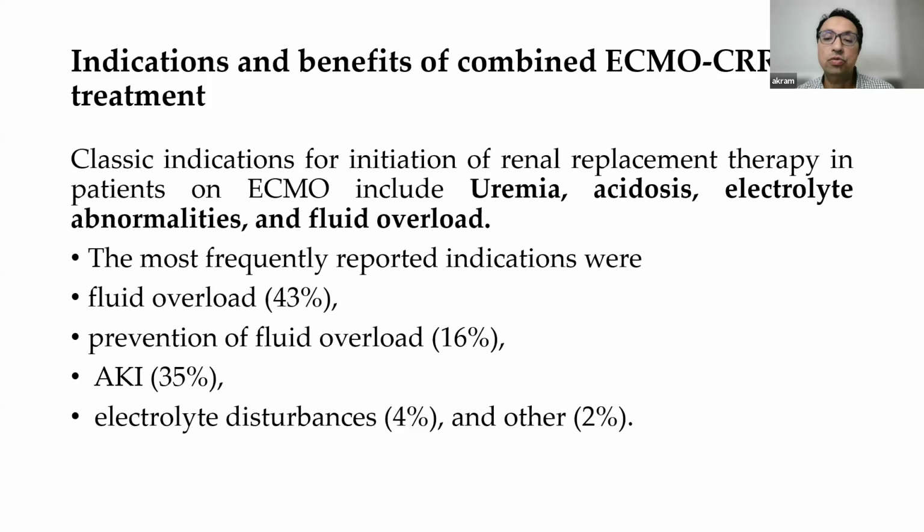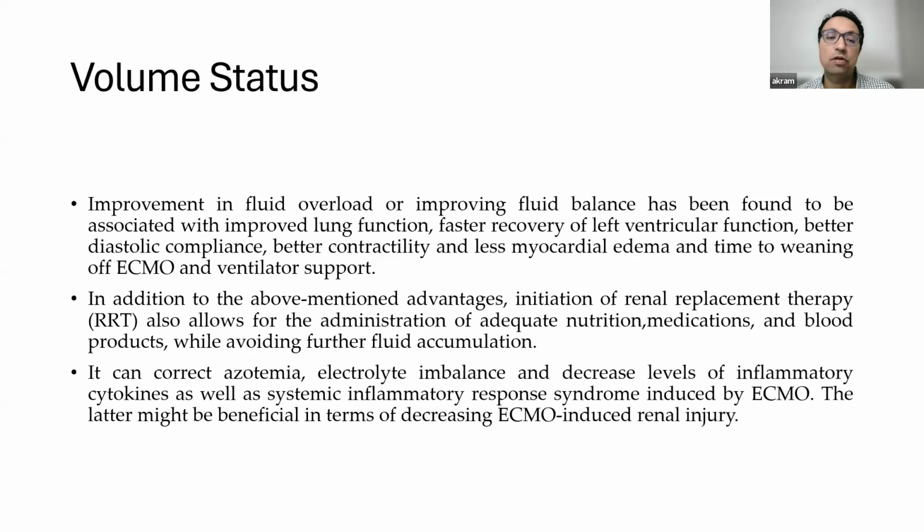So it's usually used for uremia, acidosis, electrolyte abnormalities, and fluid overload. The most frequently reported indications are fluid overload, prevention of fluid overload, and acute kidney injury with electrolyte disturbance.